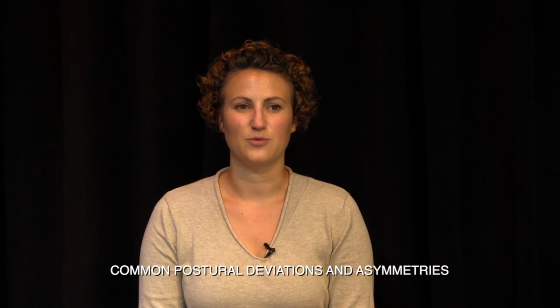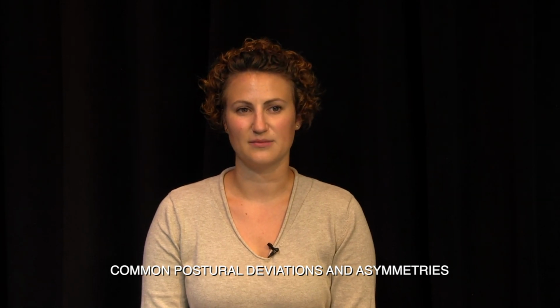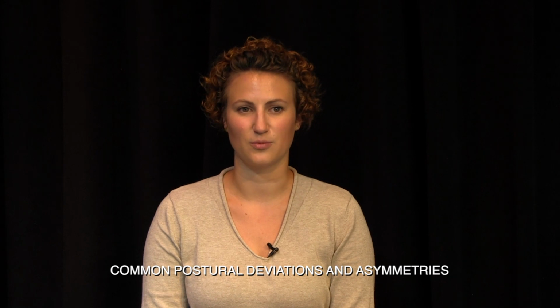Let's begin by reviewing common postural deviations and asymmetries, followed by demonstrating the placement of postural supports for a range of unique needs. We will show how to create postural support for both supine and side lying. Supine lying, which means lying on the back, is most beneficial for limiting postural asymmetries, decreasing the impact of gravity, and distributing pressure over a larger surface area. However, if it is impossible to lie supine, we will also demonstrate how to place supports for side lying.